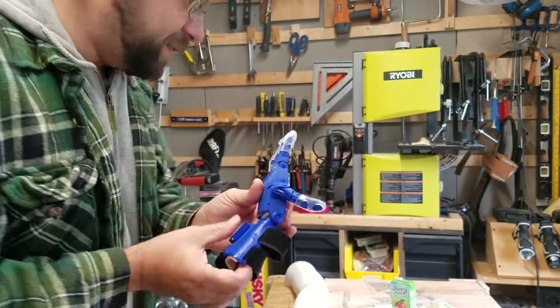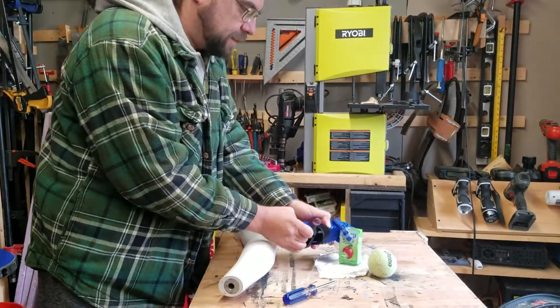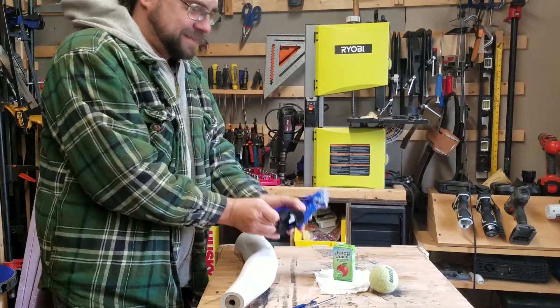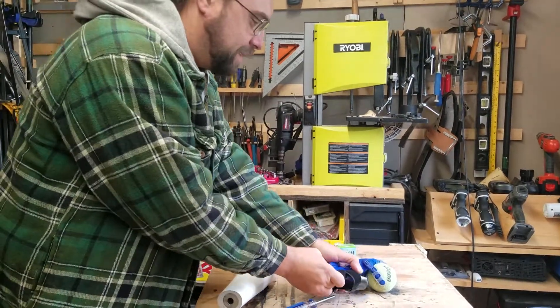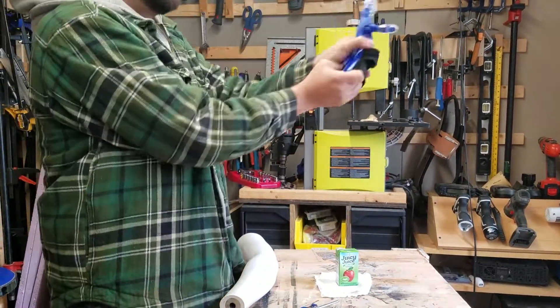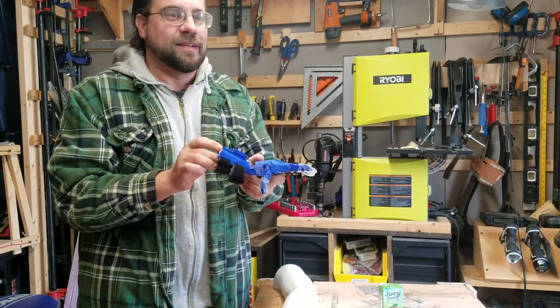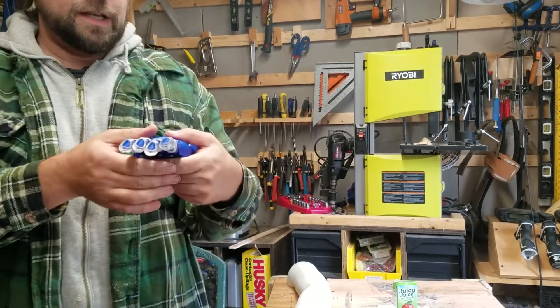Now I'll demonstrate that it can pick up an object — pick it up, drink my juice box, take it. And if I want to have fun, I can throw my tennis ball around. Now I'll show the print quality.